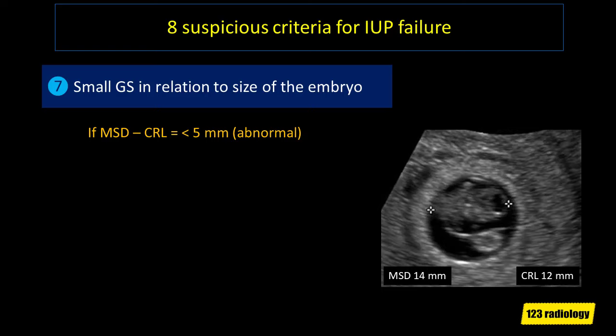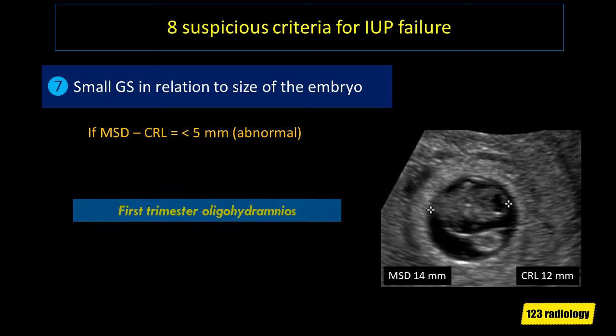The seventh suspicious criterion is a small gestational sac in relation to the size of the embryo. If the mean sac diameter minus the crown rump length is less than 5 mm, this is abnormal — sometimes called first trimester oligohydramnios. As you can see on this image, the mean sac diameter is 14 mm and the crown rump length is 12 mm, giving a difference of 2 mm. This is abnormal and suspicious for pregnancy failure, and follow-up ultrasound study is recommended.